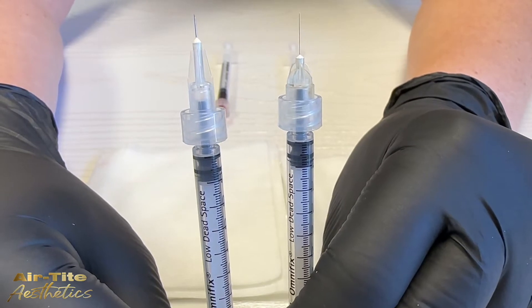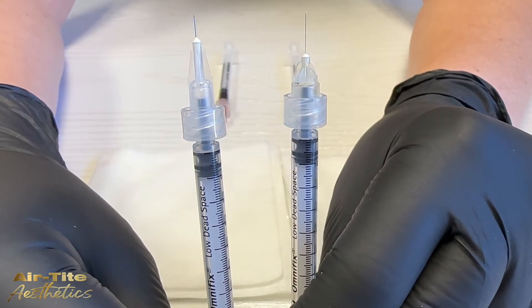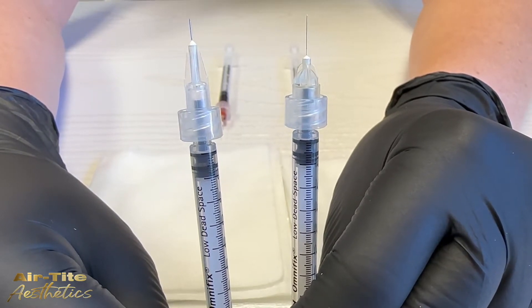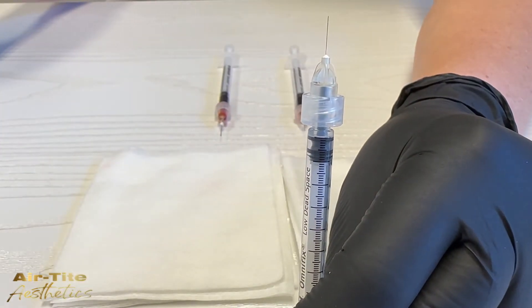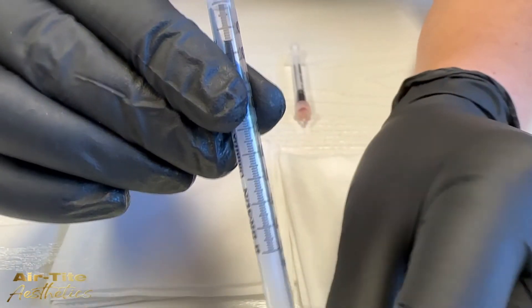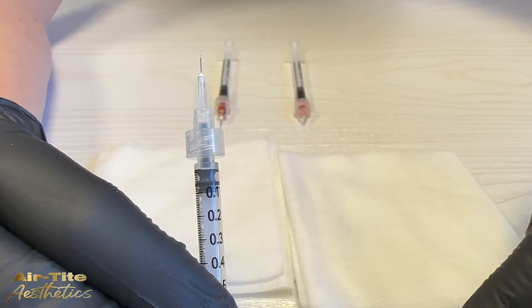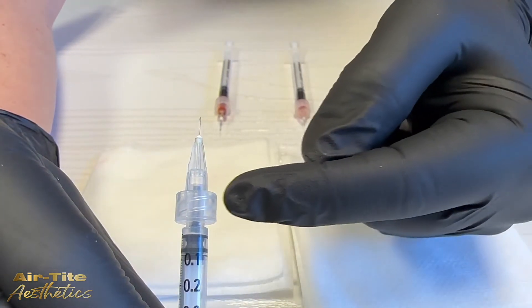In this demonstration we will help you visualize the amount of product being lost in a standard needle hub versus a low dead space needle hub. For both needles we are using a 1cc low dead space luer lock syringe, which is the recommended syringe to use with the low dead space needles to reduce product loss and maximize efficacy. You can see with the low dead space needle the syringe plunger extends all the way to the base of the needle, whereas even with a low dead space syringe in a standard needle hub there's a significant gap — right there.